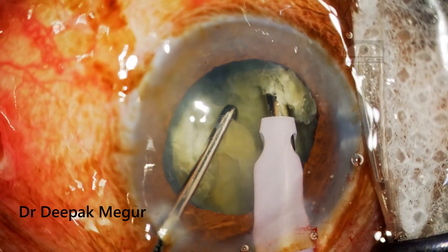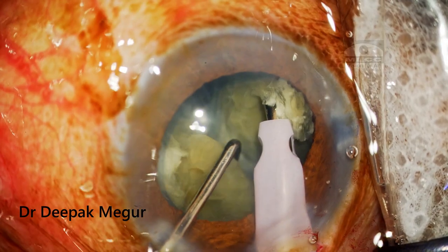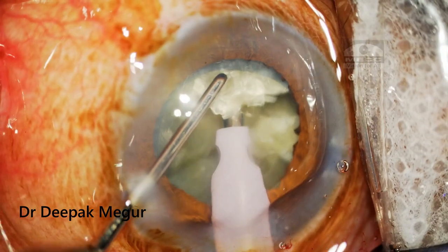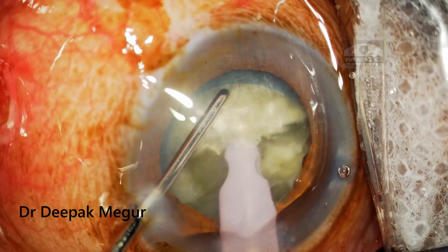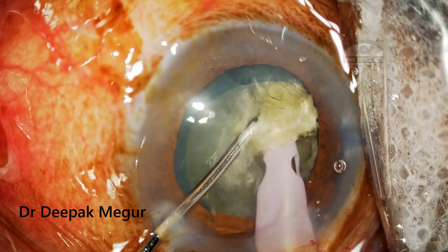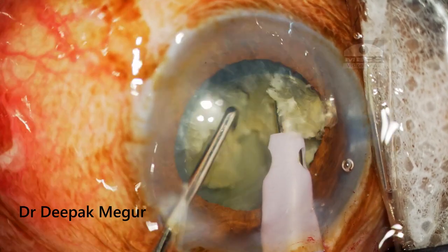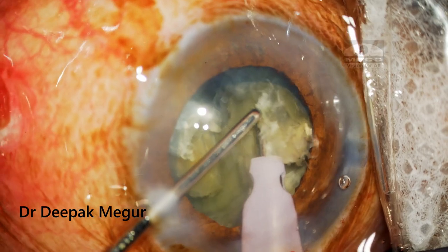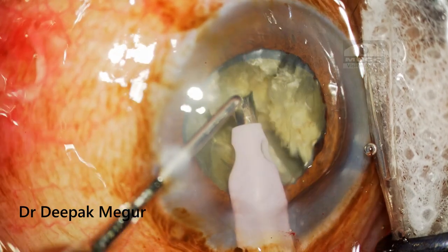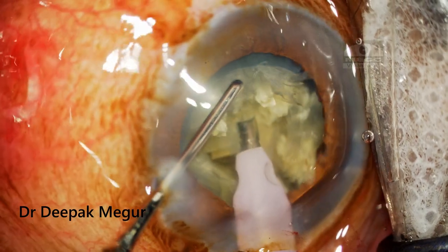As soon as the first chop is done, there is a small release of grip. Again, we give a small burst of phaco energy, re-bury, and then perform the chop. We bury the nucleus until the entire tip is buried inside, then the chopper goes in vertically down and laterally separates the fragment. The fragment is momentarily released; a short burst of phaco energy re-grasps it and the maneuver is repeated. We continue folding and chopping until we have a significant number of pieces which are then individually phaco-aspirated out.